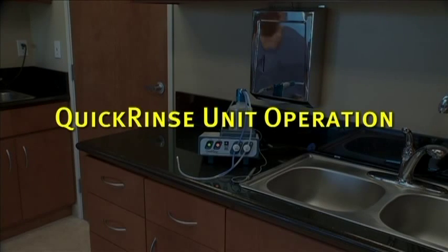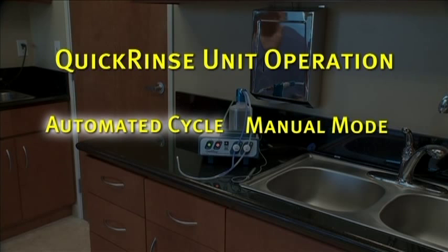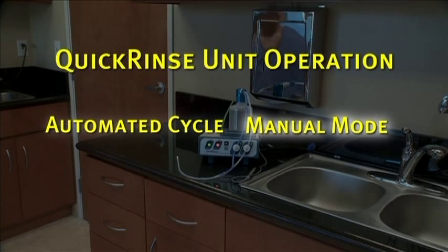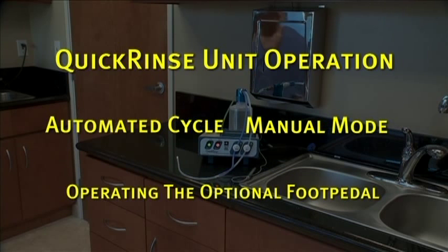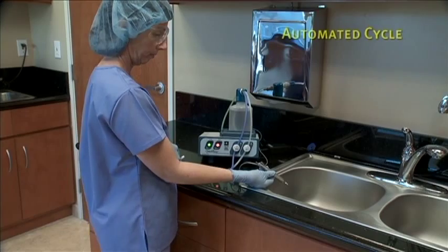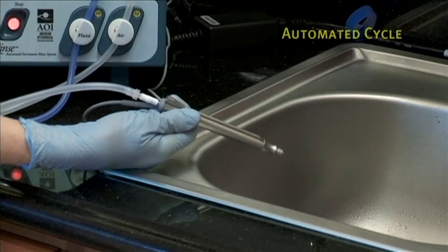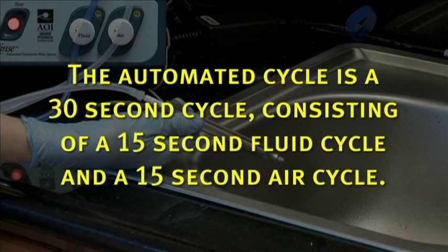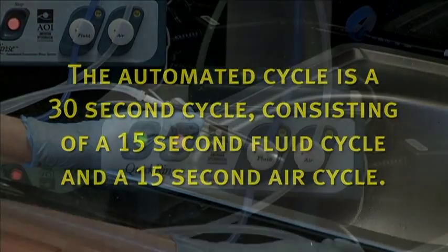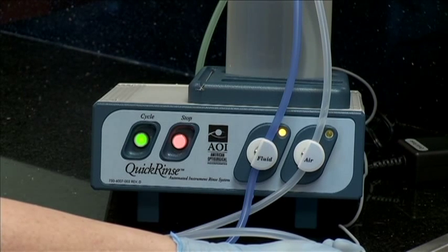When operating the Quick Rinse unit, there are two modes: the automated cycle and the manual mode. First we will go through the automated cycle, then manual mode, followed by operating the optional foot pedal. To start the automated cycle, first connect the instrument interface tube to the item to be rinsed. Make sure tubing is securely gripping the item to be rinsed. The automated cycle is a 30-second cycle consisting of a 15-second fluid cycle and a 15-second air cycle. Press the green cycle button once to begin the automated rinse cycle.